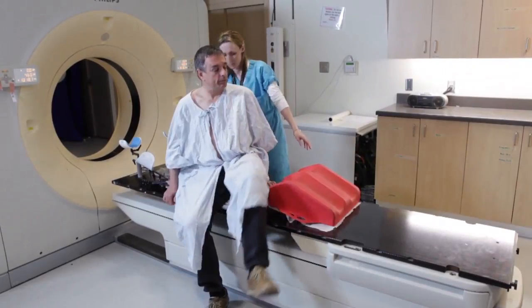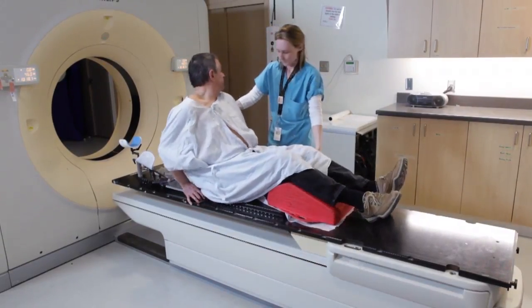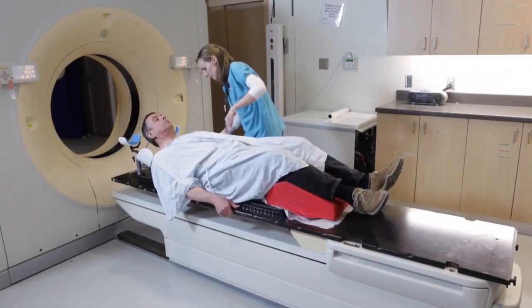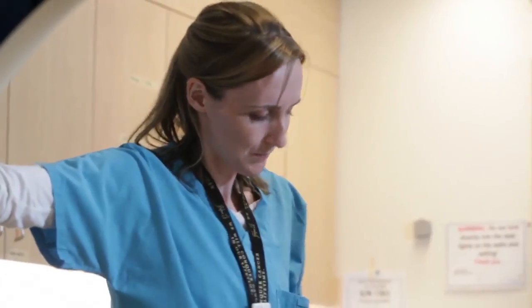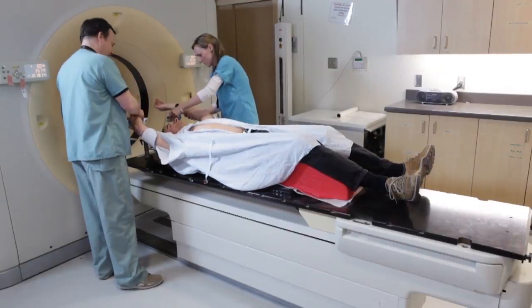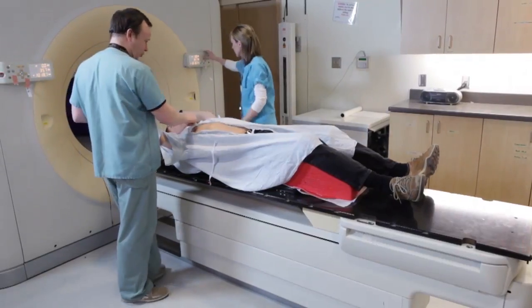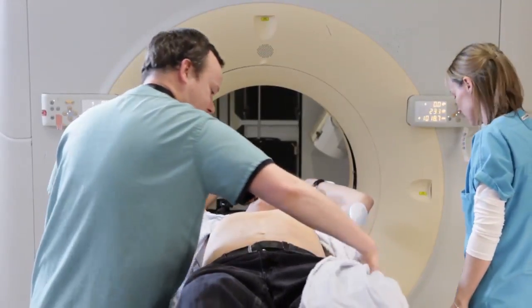You'll be positioned by the radiation therapists during the CT scan, and that position will be the same position that you will be in during every treatment. Immobilization devices are often used to help ensure a position that is relatively comfortable and will keep you from moving during treatment. We are very precise in radiation therapy — we work in a matter of millimeters, so we want to make sure that you're kept as still as possible during the treatment.